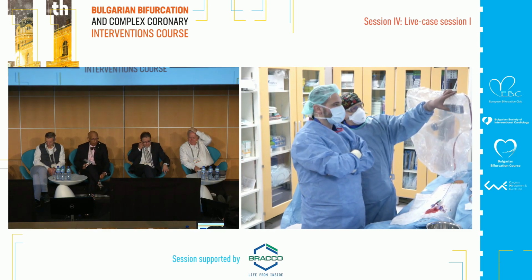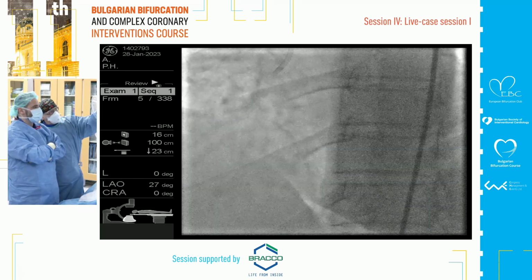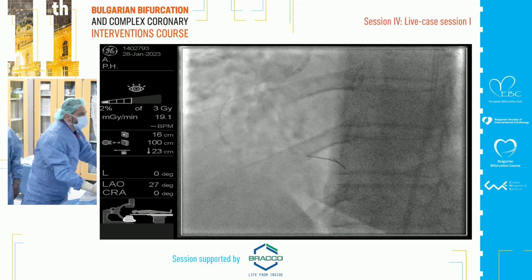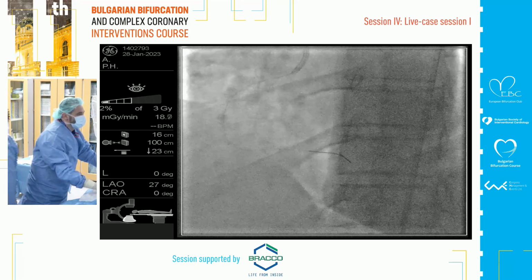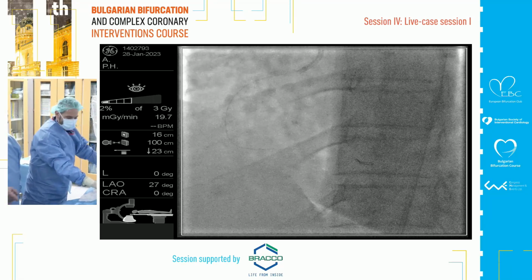Yeah, we see the angio now. We shot another one before, more clear. There is no record. We can shoot now. And we have already put in the IVUS. This is to evaluate the ostial lesion of this vessel.